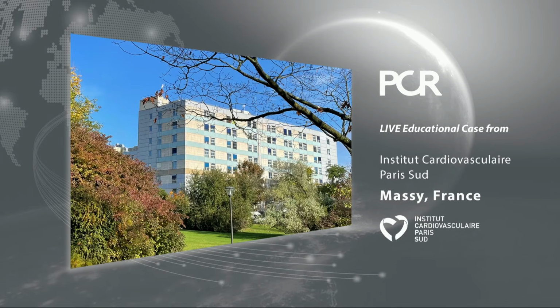We would like to see now Bernard and discuss the new study that is in a planning phase. We already enrolled first patients, and several centers in Europe will be open to test in the most complex patient population the latest platform of Nagomi with a clinical endpoint, target lesion failure. So we will see whether we are able to achieve the expected reduction and improvement in clinical outcome.